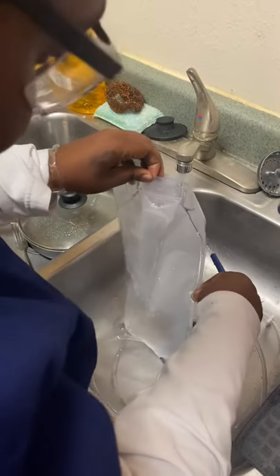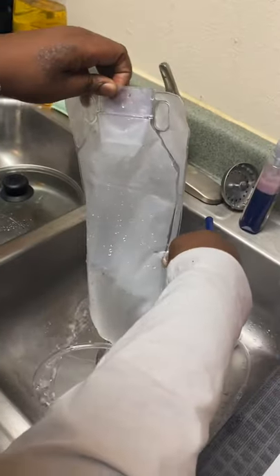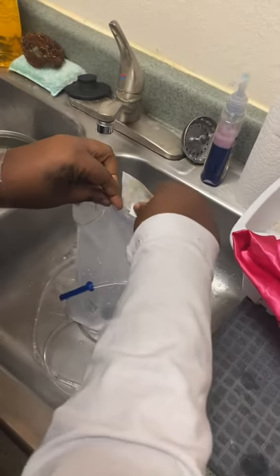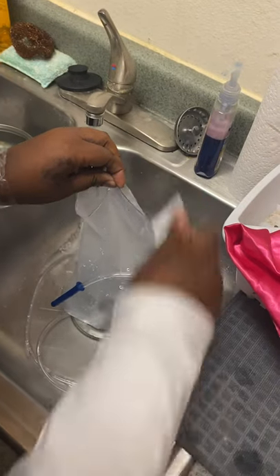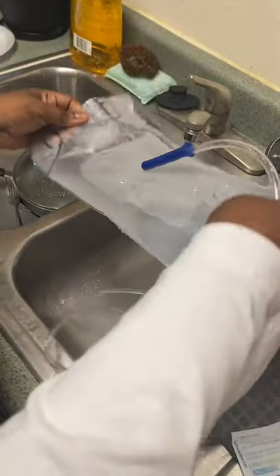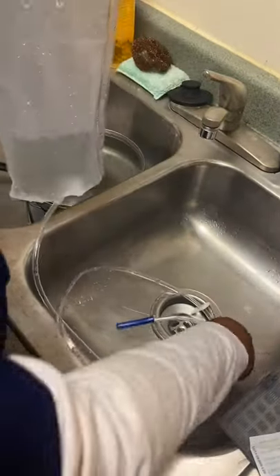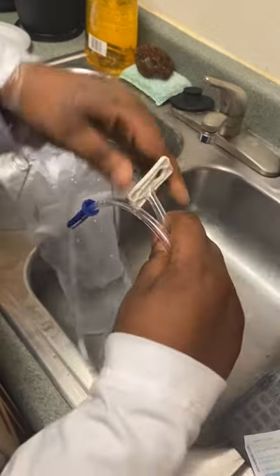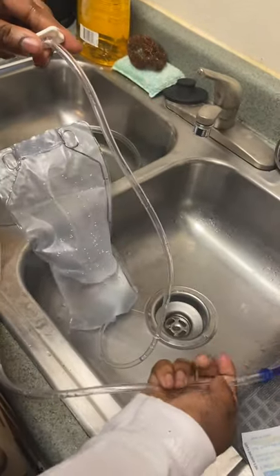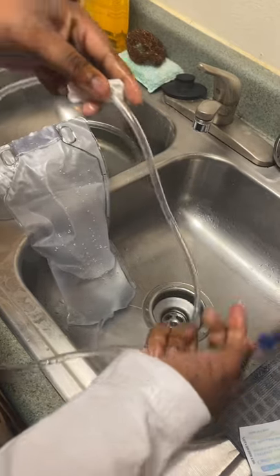Alright, 750 to 1000 milliliters of water, and I'm going to add my soap and I'm going to agitate it. Then I'm going to unclamp and prime, and then I'm going to clamp it back.